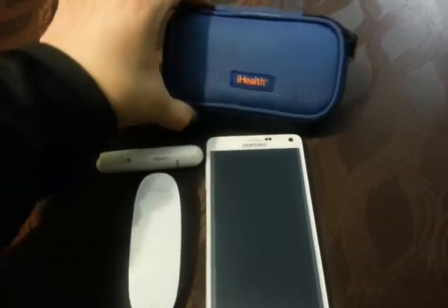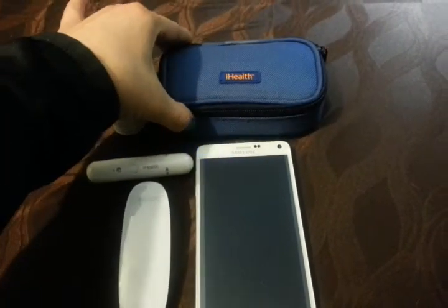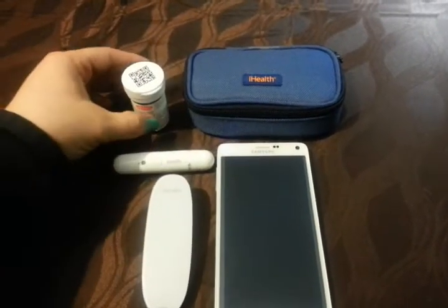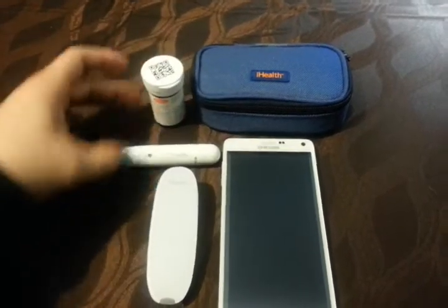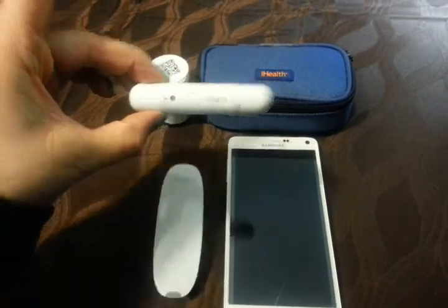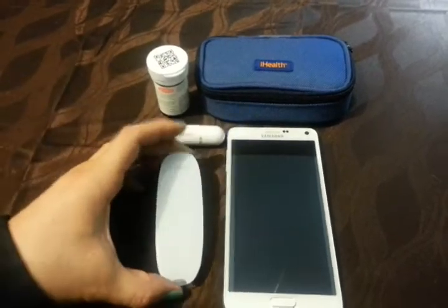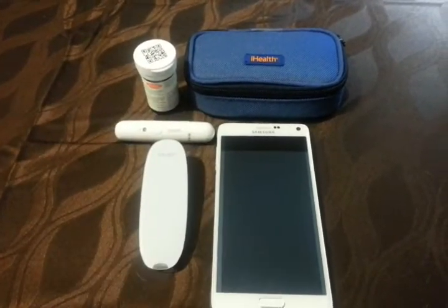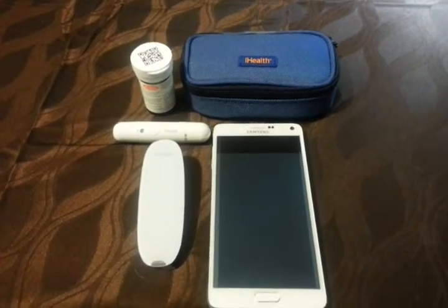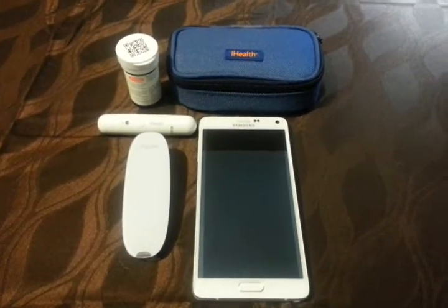We have the case — it's a good size to fit in your purse. We have the strips, we have the lancet, and we have the meter. I also have my cell phone, which I have it hooked up to or synced up with. So let's go ahead and get started.